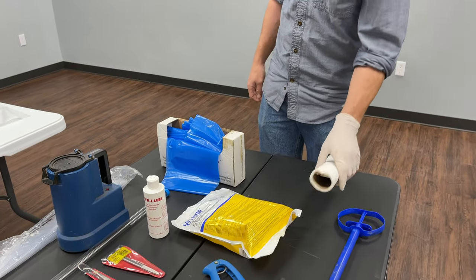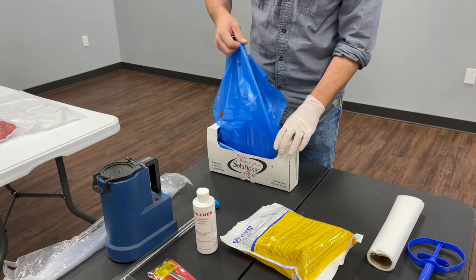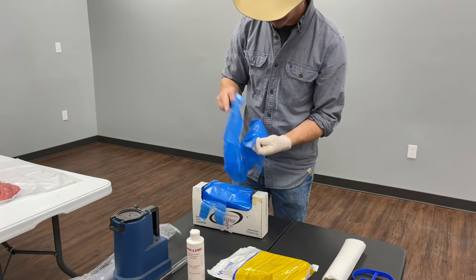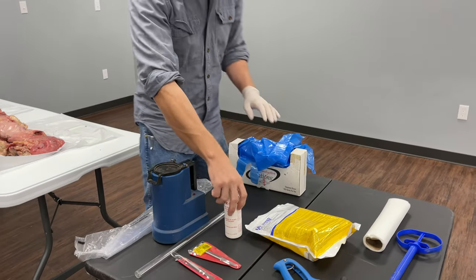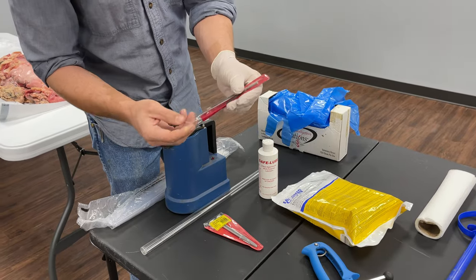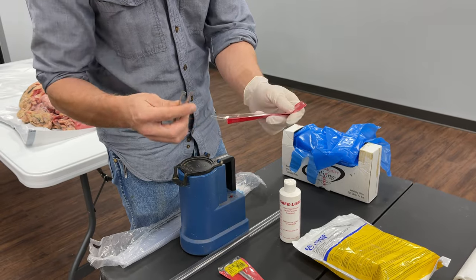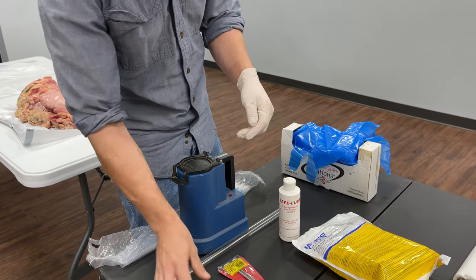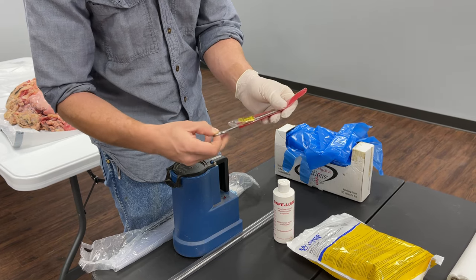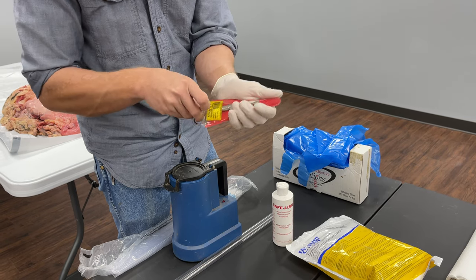Paper towels are always good to have around. These are palpation gloves — they're a full arm length. You've got to have those for the breeding part. I like to have a little lube to put on your hands. We've also got tweezers made especially to get the straws out of the semen tank, and scissors or straw cutters to snip the end of the straw.